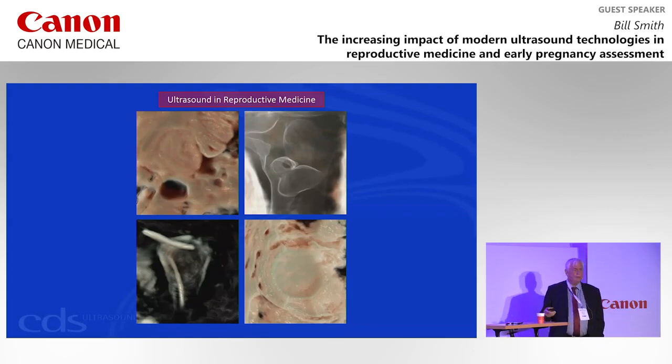But also 3D is very good for sorting out kind of complex situations, complex disease. This presented as a left ovarian mass, if you like. But playing around with the rendered image, we can see there's a corpus luteum within an ovary. There's the fimbrial end of the tube stuck to the ovary. These are adhesions here with loculated fluid. We can sort out what's going on in a complex situation.